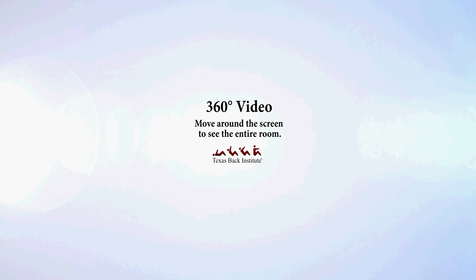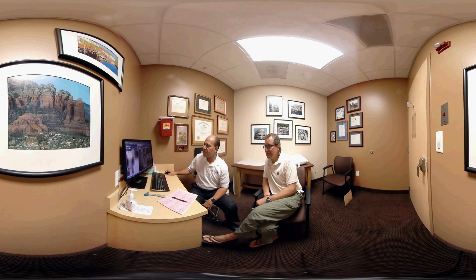Hi, my name is Dr. Richard Geyer from the Texas Back Institute. What I would like to show you today is a patient that has been evaluated for a cervical artificial disc, and take you through the surgery utilizing a new high-tech technology called 360. Feel free to take your finger and move it across the screen to see other parts of the visual images. What I'm doing here is going over the x-rays.